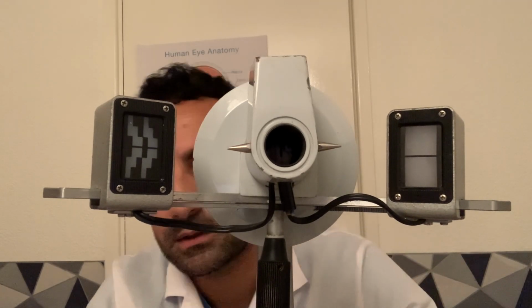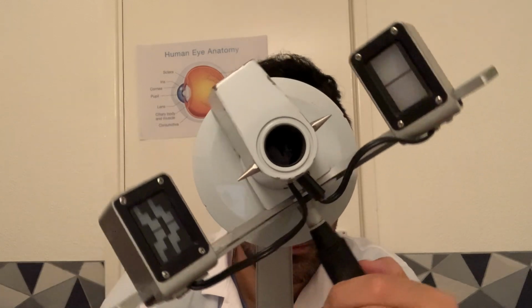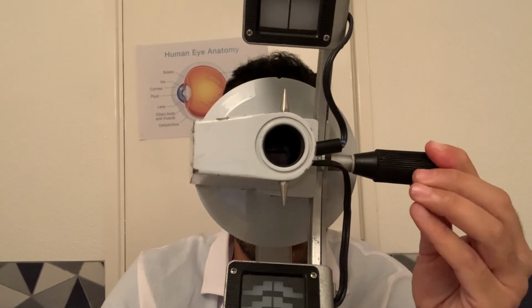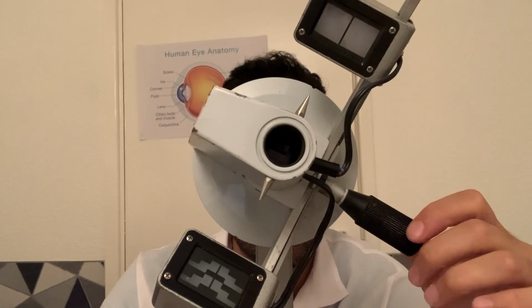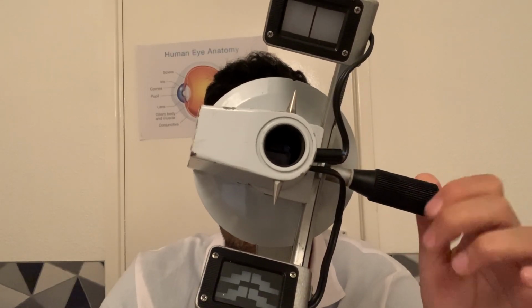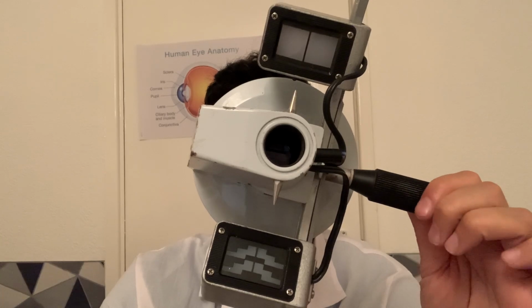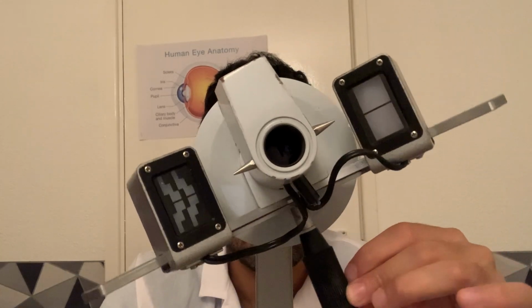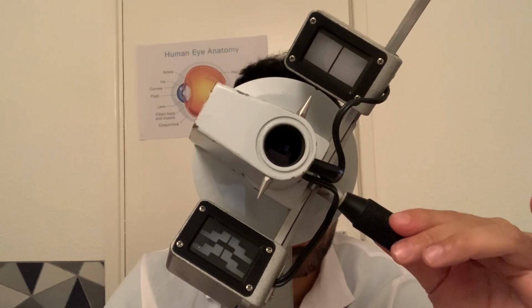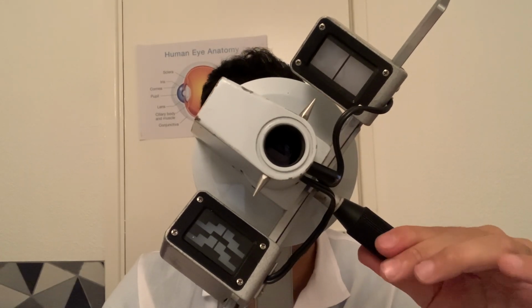Okay, now just blink normally for me, and I will just refine the readings. Excellent. Just fine tuning here.